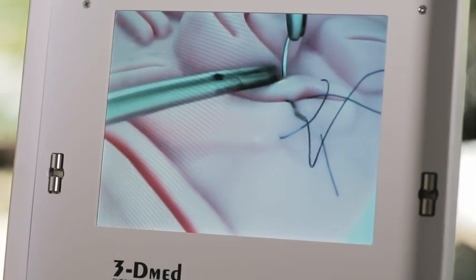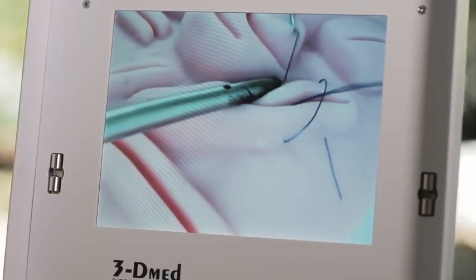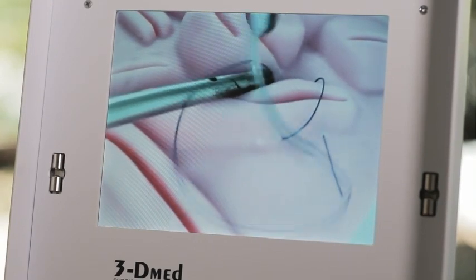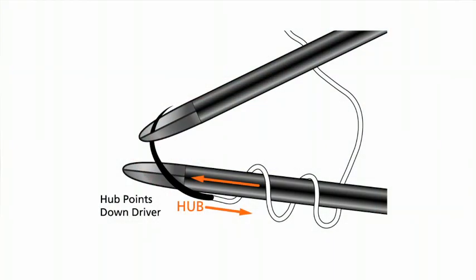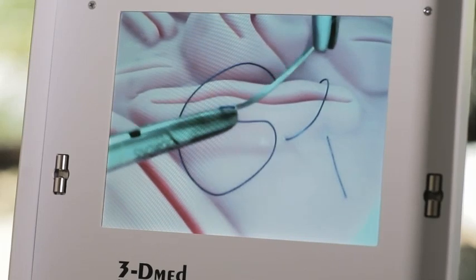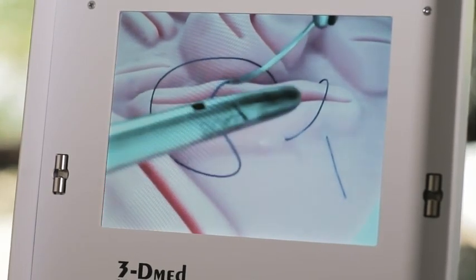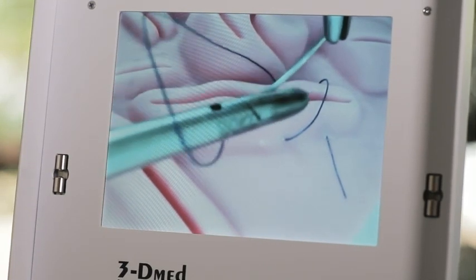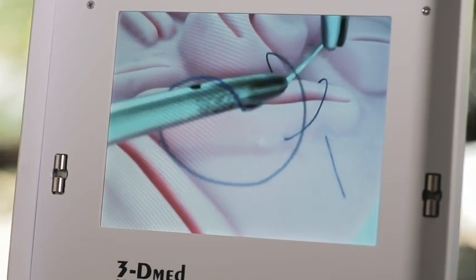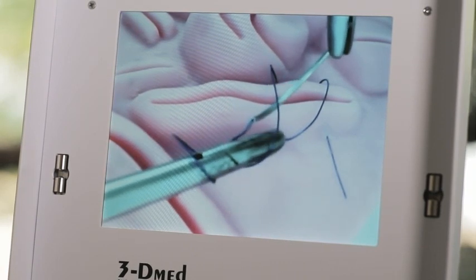Now we're going to tie the knot. I'll pull the suture through. I will want to align the hub of the needle with my driver so I'm just going to pull it towards myself. These are now parallel.